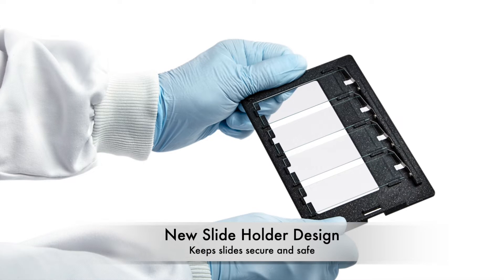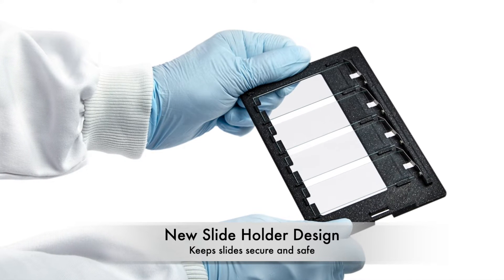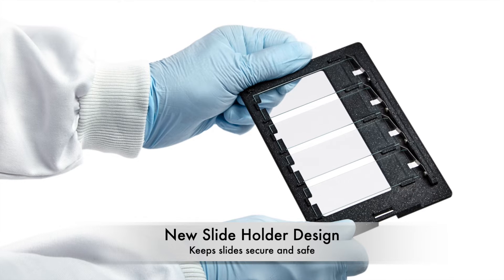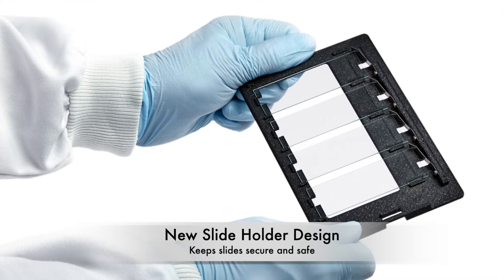The SL160 Slide Holders are simple to load, economical, and suitable for long-term slide storage. They securely hold the slides to the plate with several features that prevent slides from falling through or being damaged.